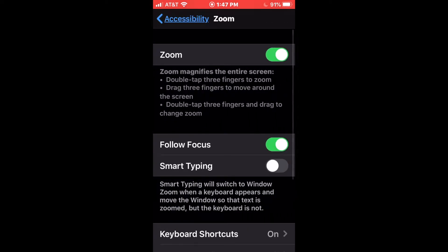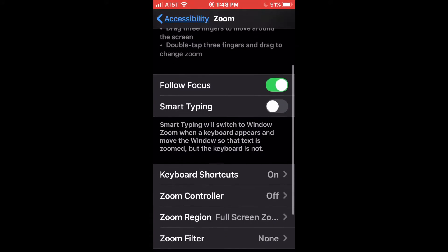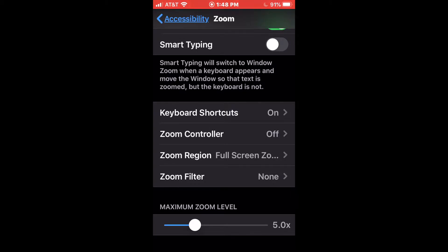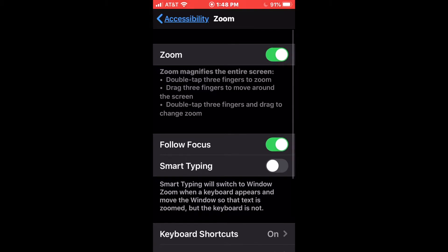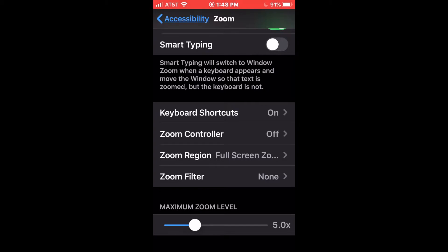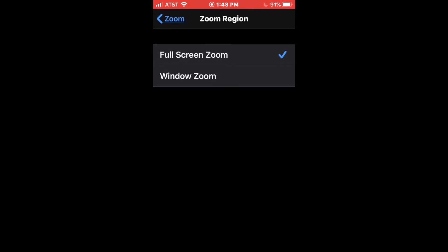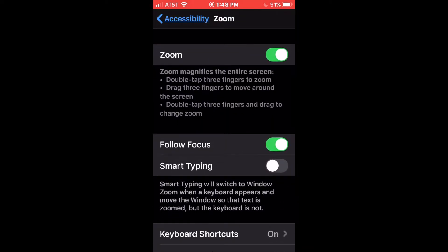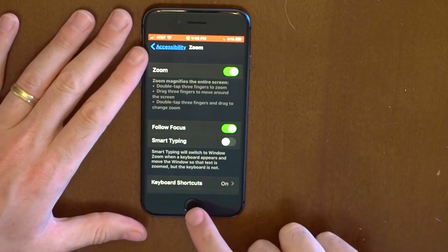So let's go into zoom. First of all, we have a switch to turn on and off zoom — we want to enable that, so I've got that enabled at the moment. We're also going to see a number of options in this menu. We're going to be most interested in making sure that zoom is turned on, and then looking at the zoom controller and the zoom region. By default, the zoom region is set to window zoom. I think full screen zoom is probably better in most cases, but by default it does seem to be set to window zoom. So let's take a look at that first. It tells us at the top of this menu what zoom does and how to work it: double tap three fingers to zoom, drag three fingers to move around the screen, double tap three fingers and drag to change zoom. Let's take a look at how that works in practice.